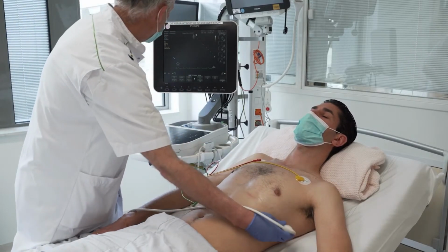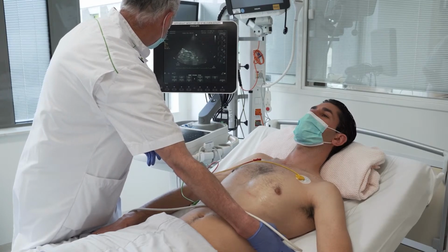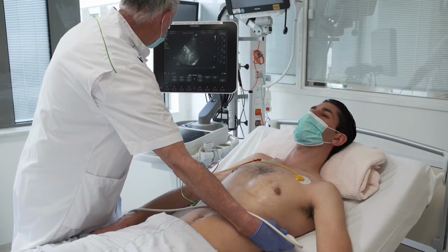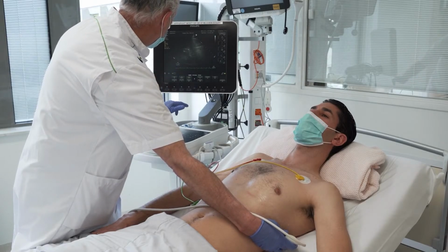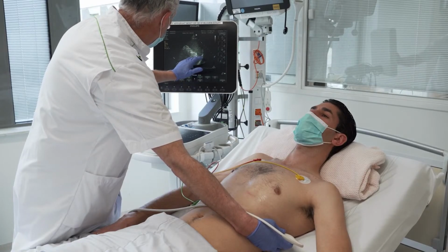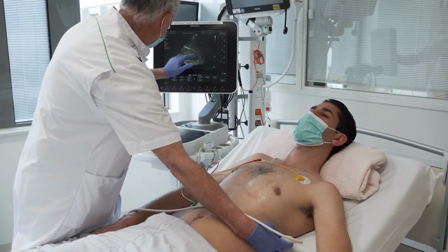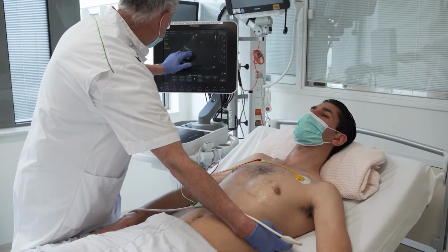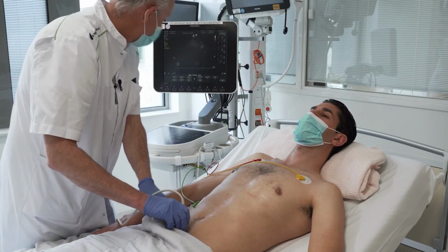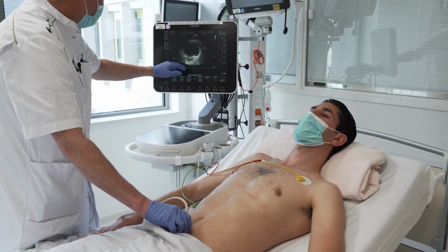I'm going to the left side, do the same. I'm going to look for my diaphragm. Again, air, no effusion, no subphrenic fluid, no fluid between the spleen and the kidney. Finished. I go to the suprapubic view.